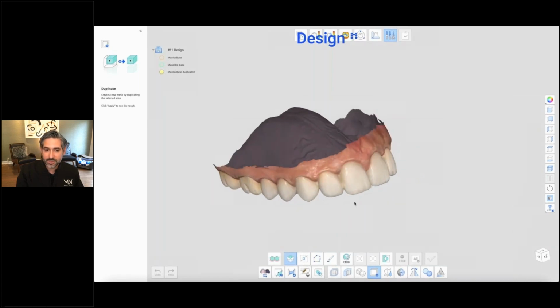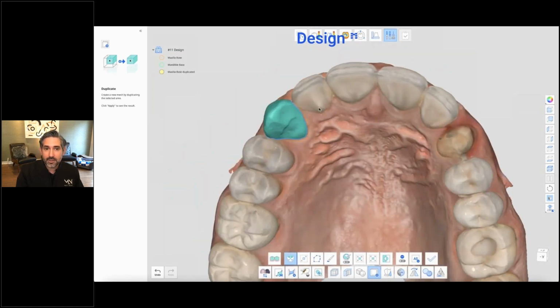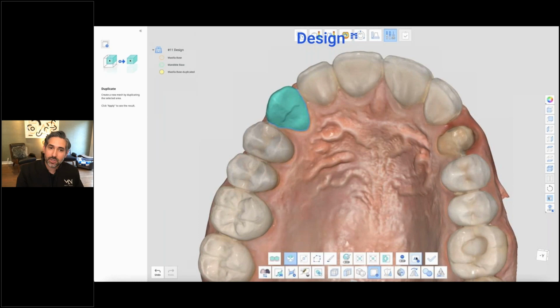So I'm going to pick number 6, and you can again refine the selection as needed, but this did a pretty good job. But I want to try to do it as a veneer. There's another way you can do it though. You could leave it like this and erase it later. So different workflows, I'm still figuring out which one would be my favorite, but right now I just said let's take it as a veneer and bring it over.